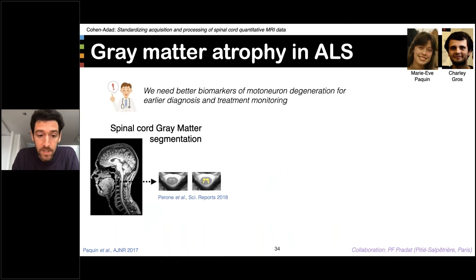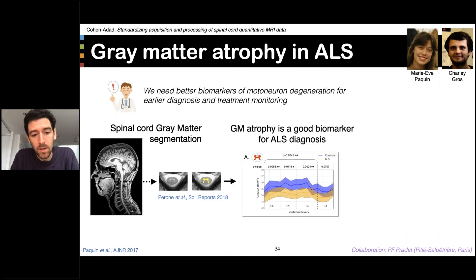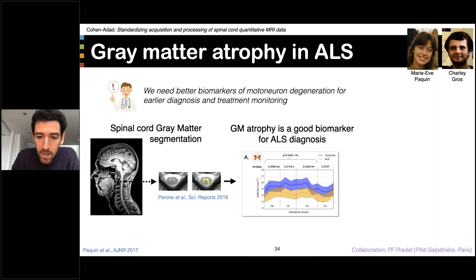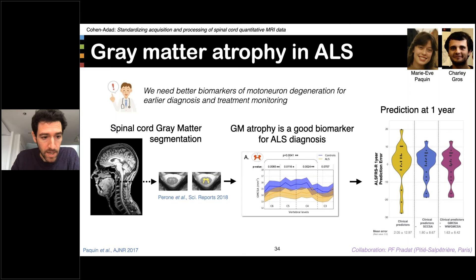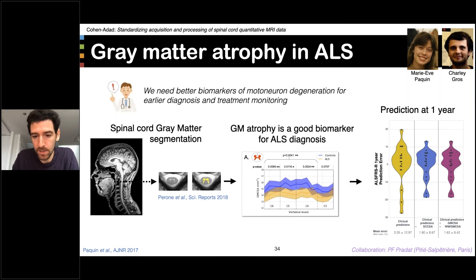Moving to another disease — amyotrophic lateral sclerosis or ALS — SCT was used to segment the spinal cord gray matter of patients at an early stage of ALS. It was demonstrated that spinal cord gray matter atrophy is a better biomarker than spinal cord atrophy for distinguishing patients from healthy controls. A follow-up study showed that gray matter CSA is also a relevant biomarker for one-year prognosis of motor scores, specifically ALS-FRS, and prognosis is more accurate when combining clinical predictors with gray matter cross-sectional area.